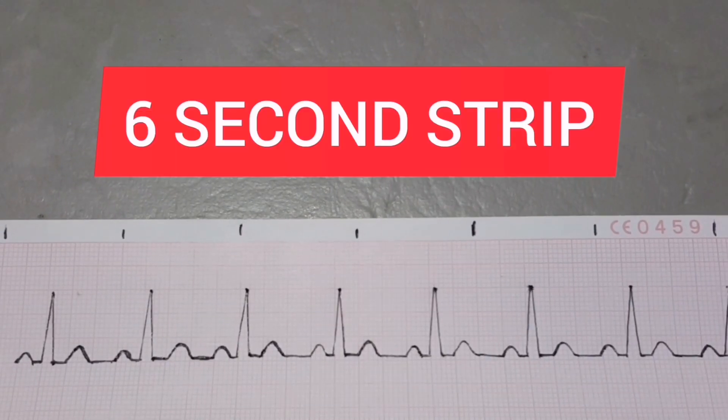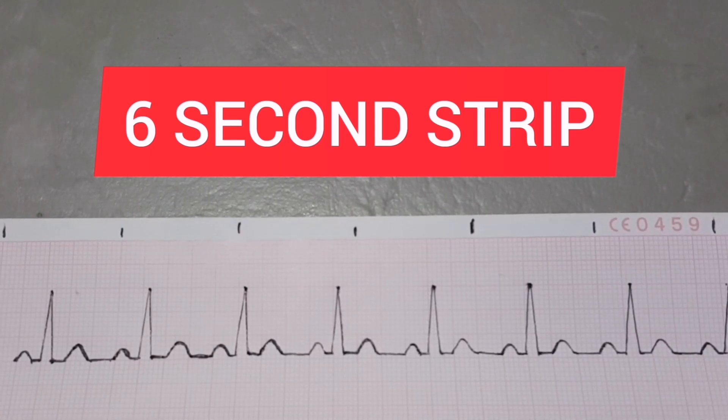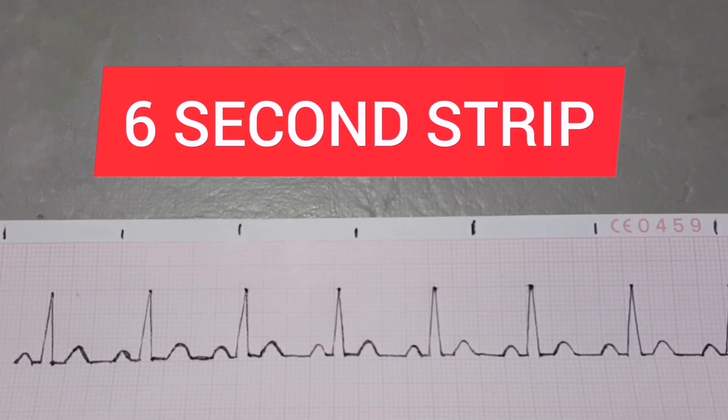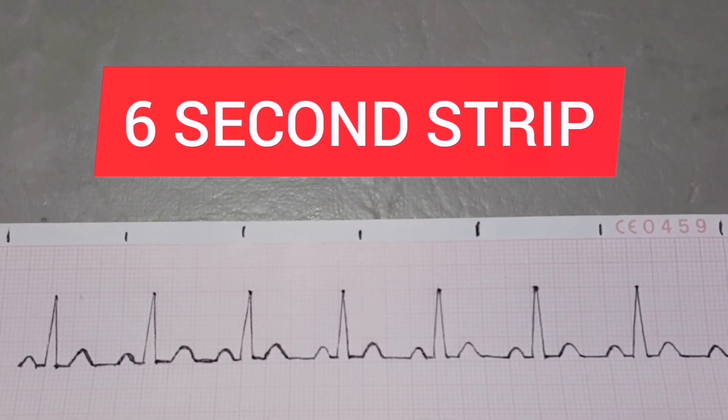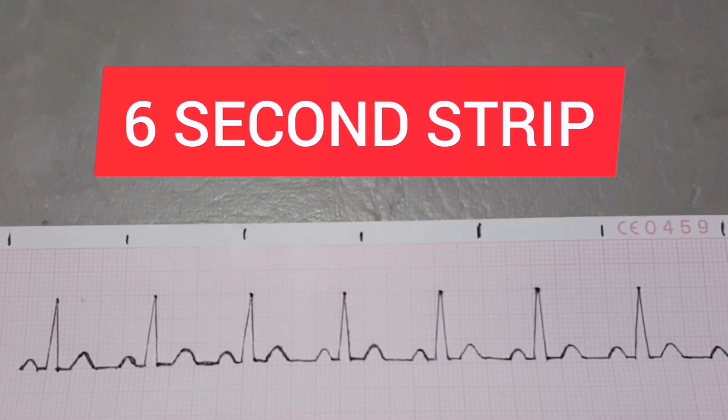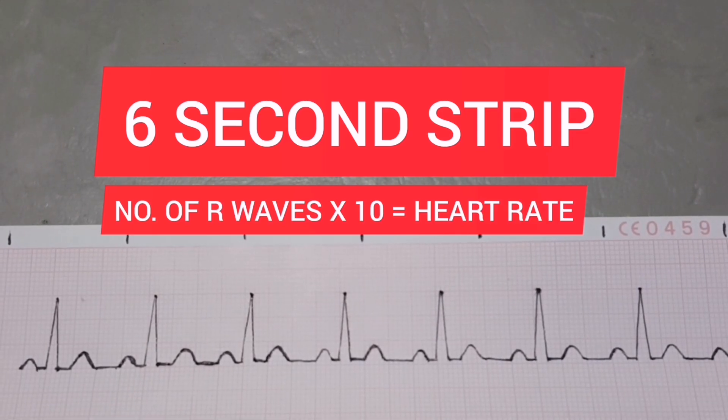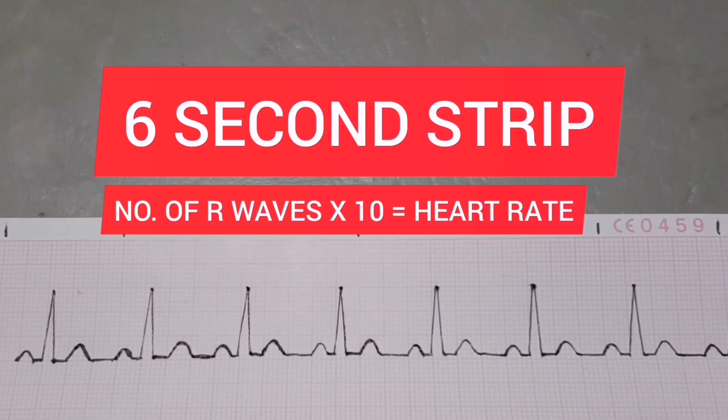For the six-second strip, just count 30 big boxes horizontally so that you will have a six-second strip. Now, count the number of R-waves in a QRS complex and multiply by 10. Simply, R-waves times 10 is equal to heart rate.